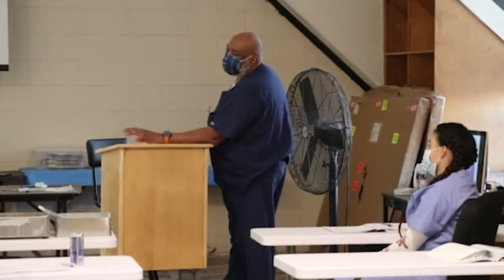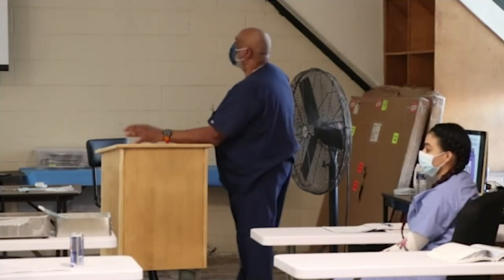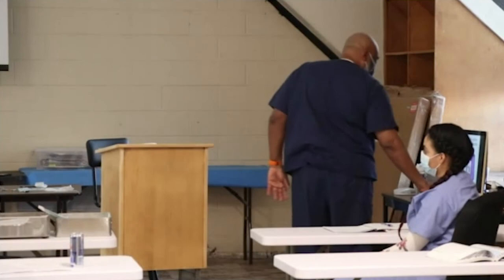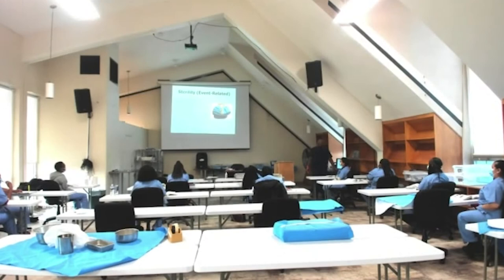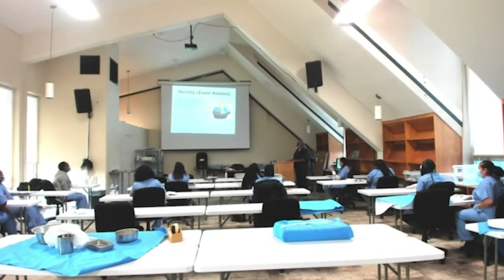Now, prep and pack, negative or positive air pressure? Decon, negative or positive air pressure? Are we using this? Why not? The lock sticker looks good. Suppose it's the last one.